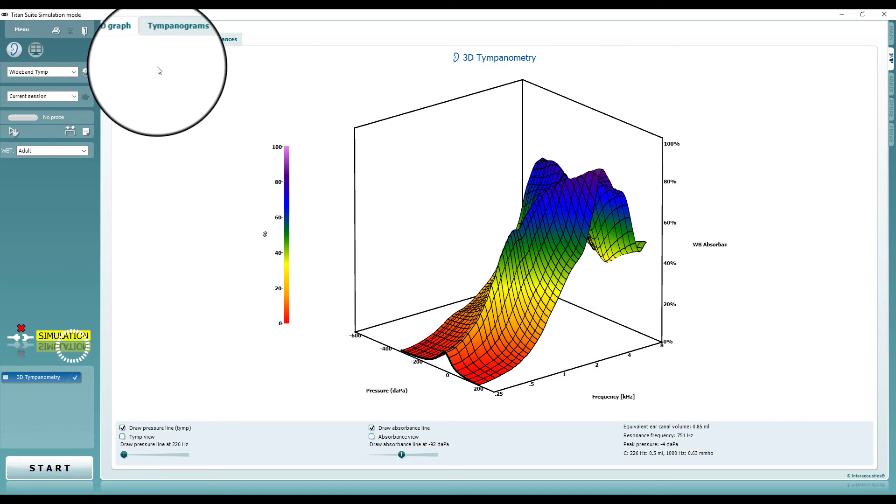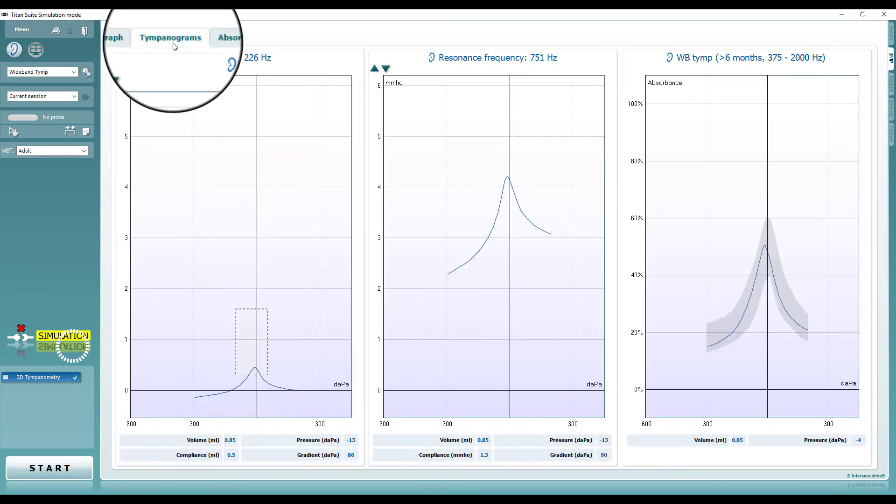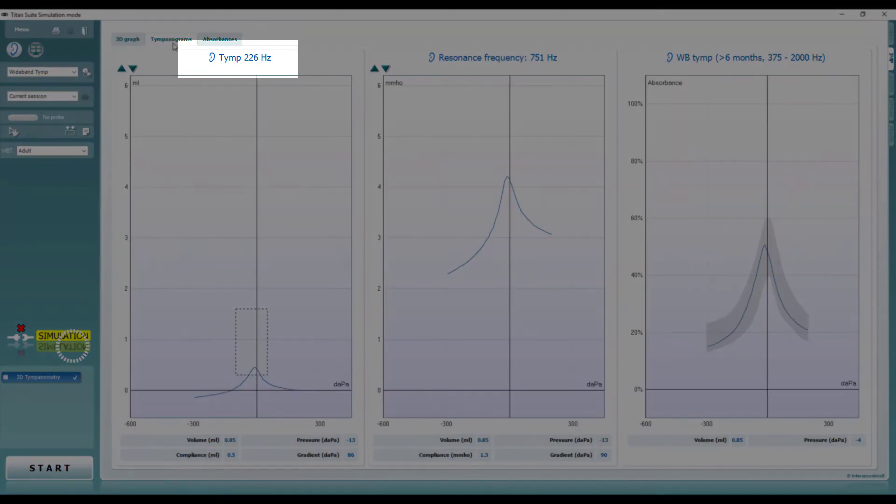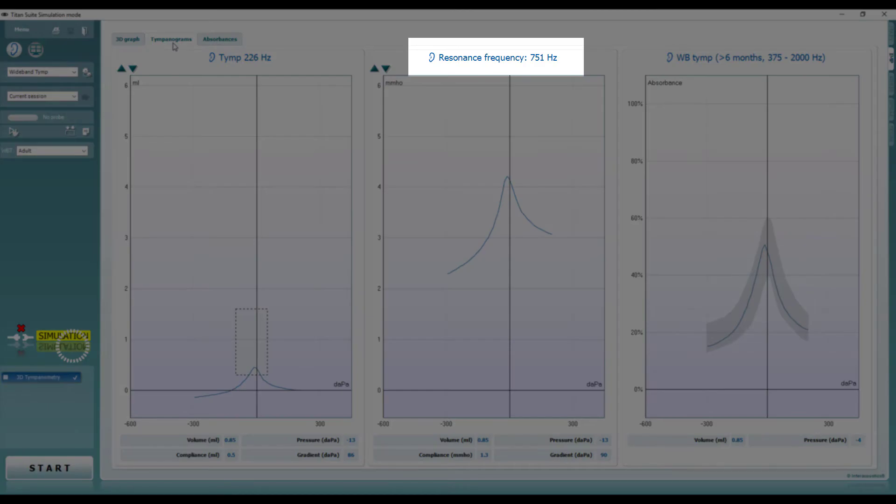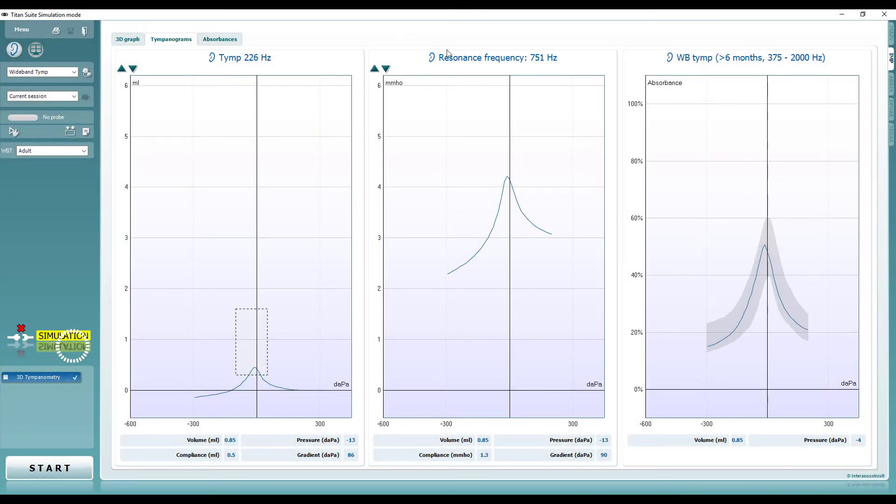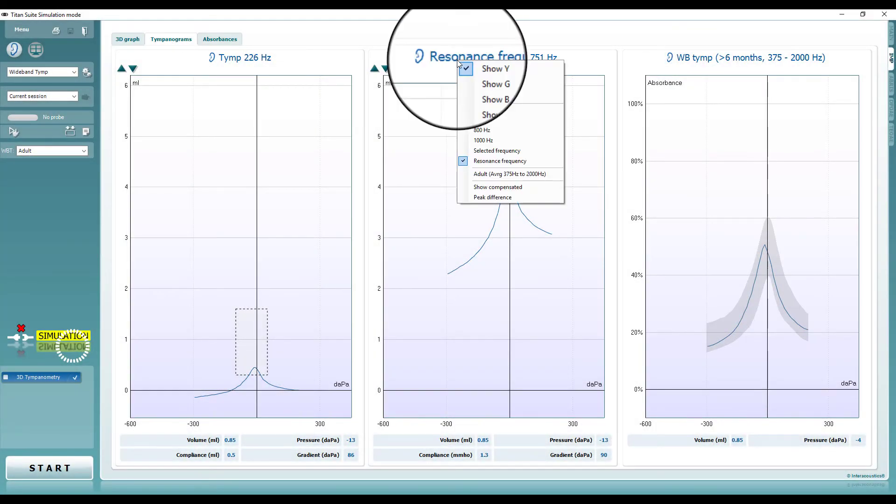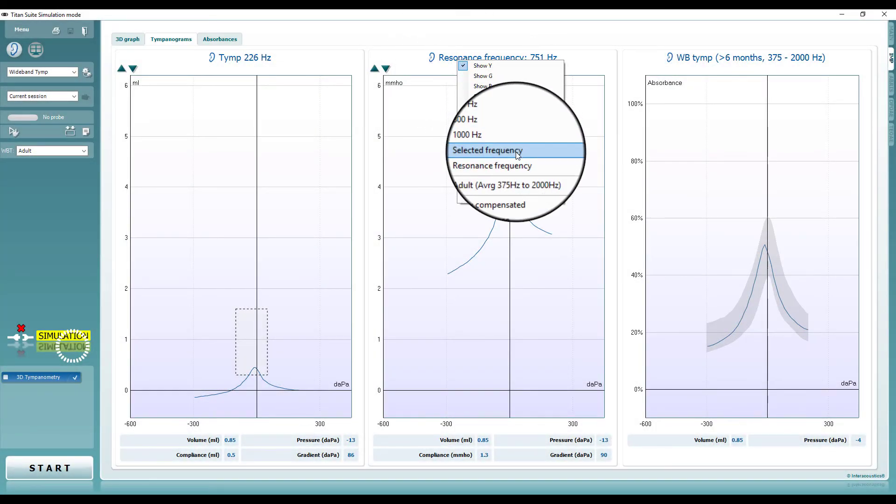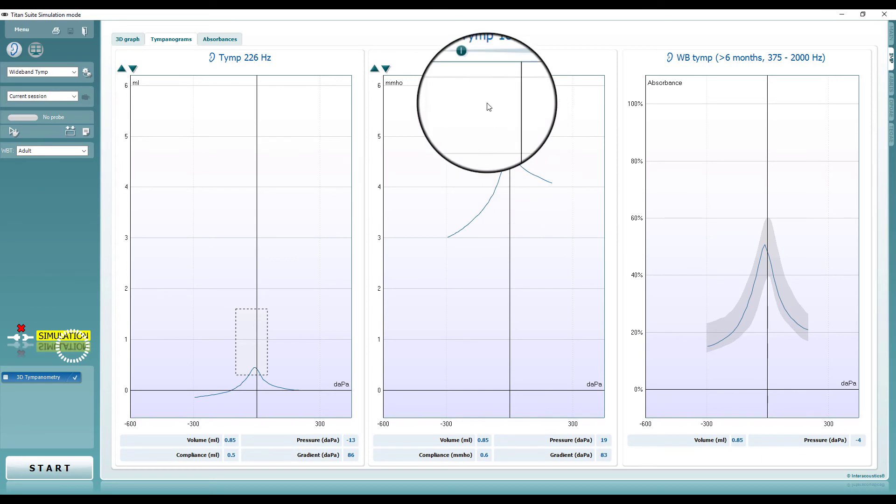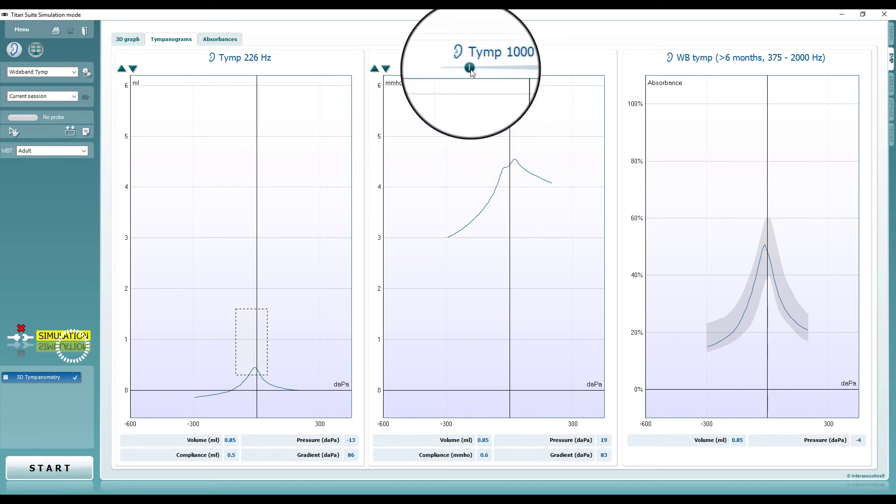Under the tympanograms tab, it is possible to customize the displayed graphs. A suggested default display is the 226 hertz tympanogram, the wideband average tympanogram, and the resonance frequency. For each patient, these can be changed live depending on the needs for the best clinical interpretation.